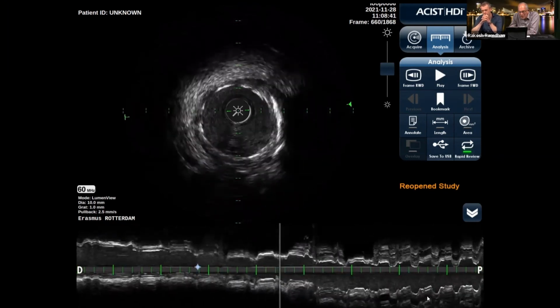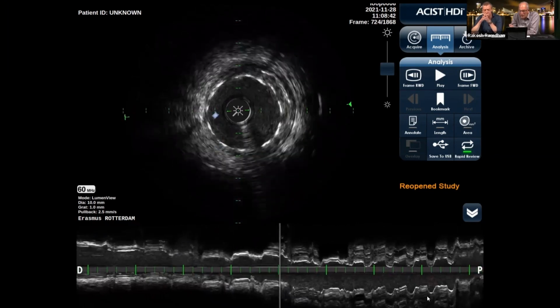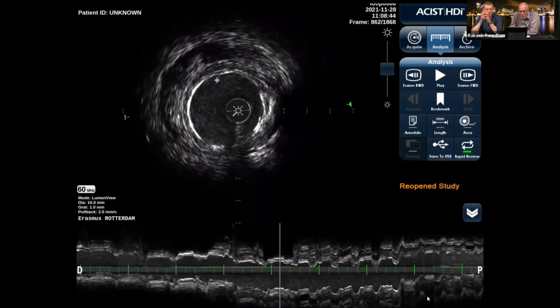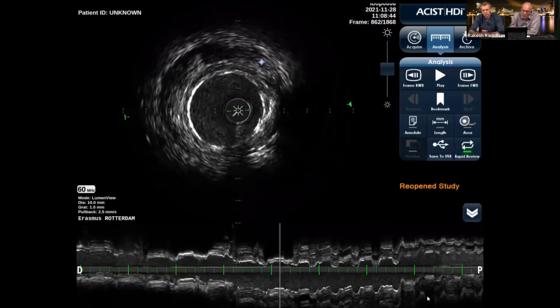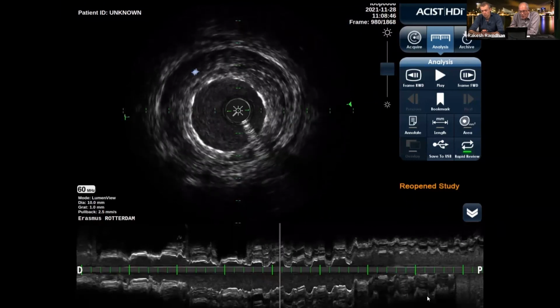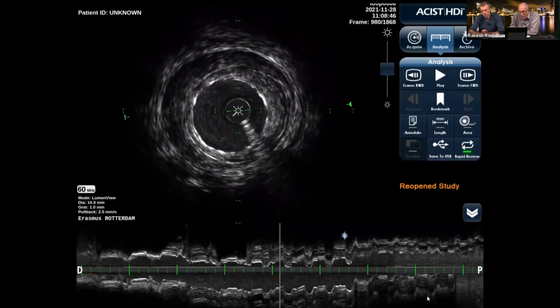Now we see, this is a Trio stent, post-dilated with a 3.5 balloon. Look at this. This is what you want to see in here. If we continue, you see behind the stent the media, and this is the blown-up adventitia. That has nothing to do with stent expansion. The position is exactly where you want to have it, against the intima, and you see the media in here. Believe me, if we repeat the IVUS after a couple of months, you will see that this is completely resolved and we have a normal adventitia. You see the hematoma is still there, but now the stent is there. We have a good lumen.